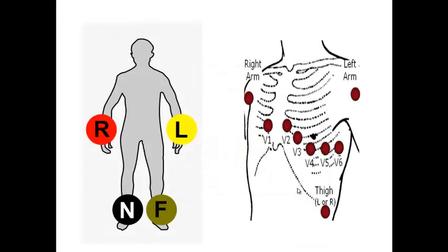If we want to know the attachment of the ECG leads, we discussed how the chest leads are attached to the chest wall according to the surface anatomy of the thoracic wall. We also have the attachment of the 4 limb electrodes, which, as we said, will show us 6 ECG leads. But we need to know the usual arrangement of this machine. We have 4 colors of the limb leads: yellow, green, red, and black. Usually we use an arrangement for the colors like this.